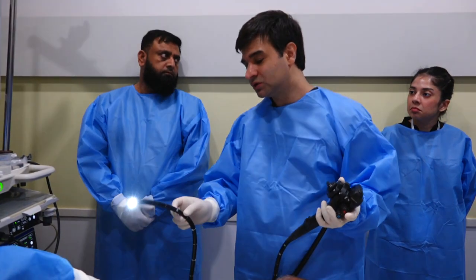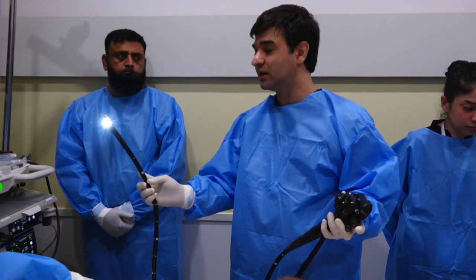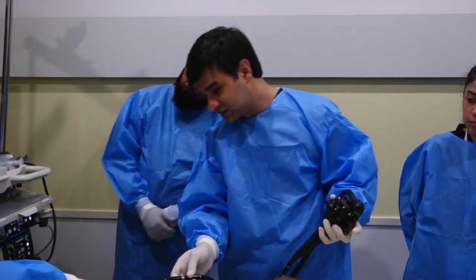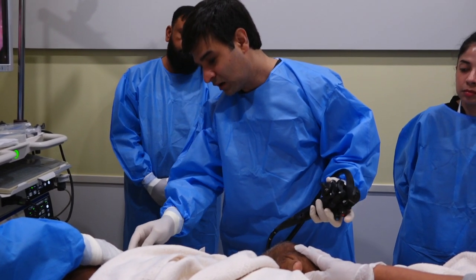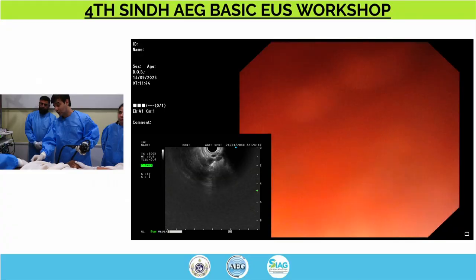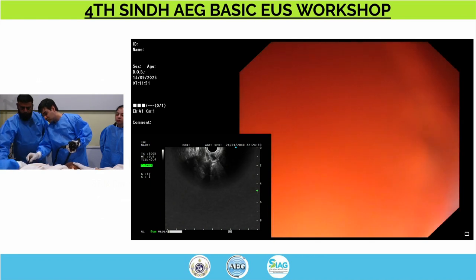Just understanding the anatomy of the hypopharynx is helpful in this case, and it's usually beneficial to put a slight tilt in the scope and bend it slightly so that it's very easily introduced over the tongue to a point where I'm hitting some structure at the back, and that's usually the posterior pharyngeal wall. So once we hit that area, lift the head up a little bit.